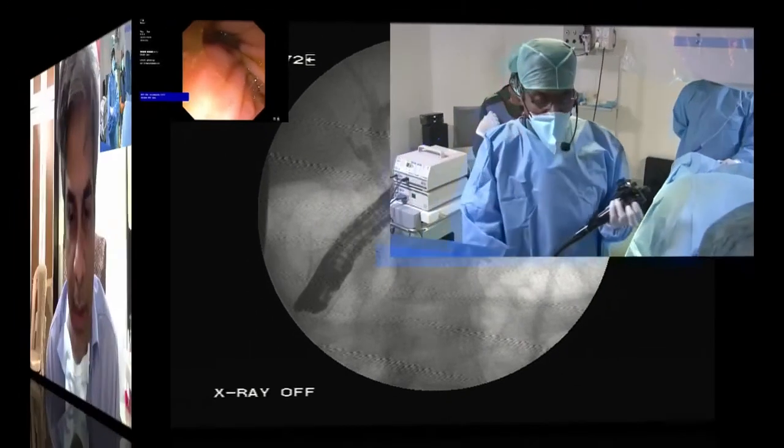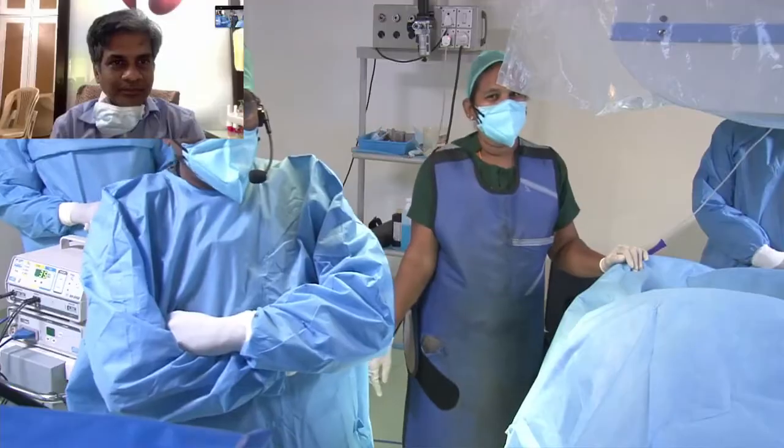Thank you for being with us. In the situation that you are in your own OR, and you have the setup where you have the ability of doing ERCP and laparoscopic surgery together, wouldn't you want your ports to be in place and not take them out completely? Sometimes you may require some laparoscopic manipulation in case of some difficulty in trying to guide a stone down. See, that is a good thought.